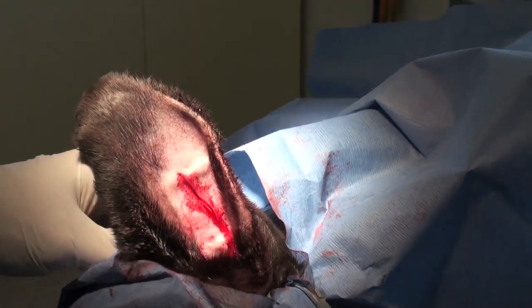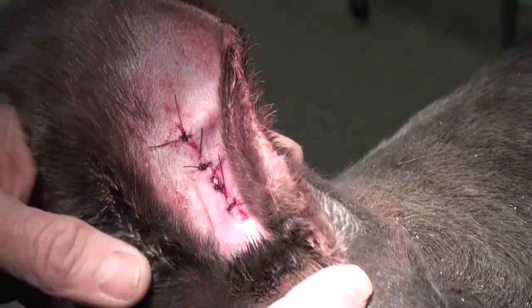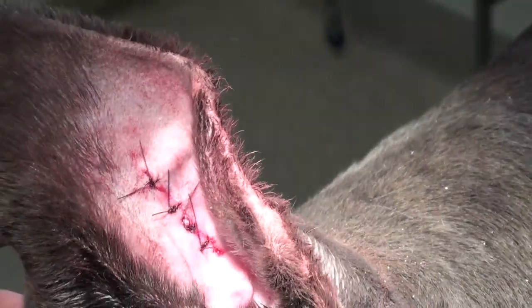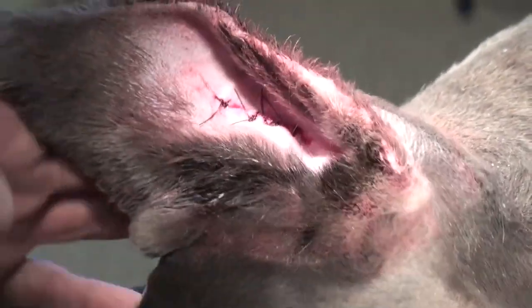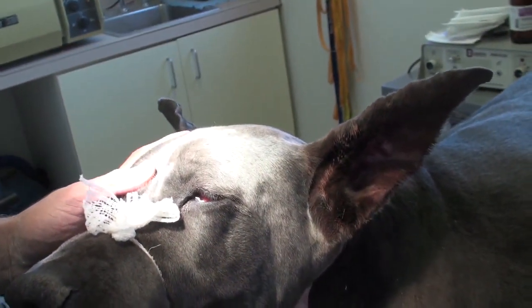We're just going to close this area and the surgery is going to be done. I did a single interrupted pattern and used 2-O-PDS to close the skin. The implant seems really well attached and in perfect position. You really cannot see it with the hair unless you know what you're looking at. The ear feels and looks perfectly natural — now they're both standing up, which is exactly the idea.